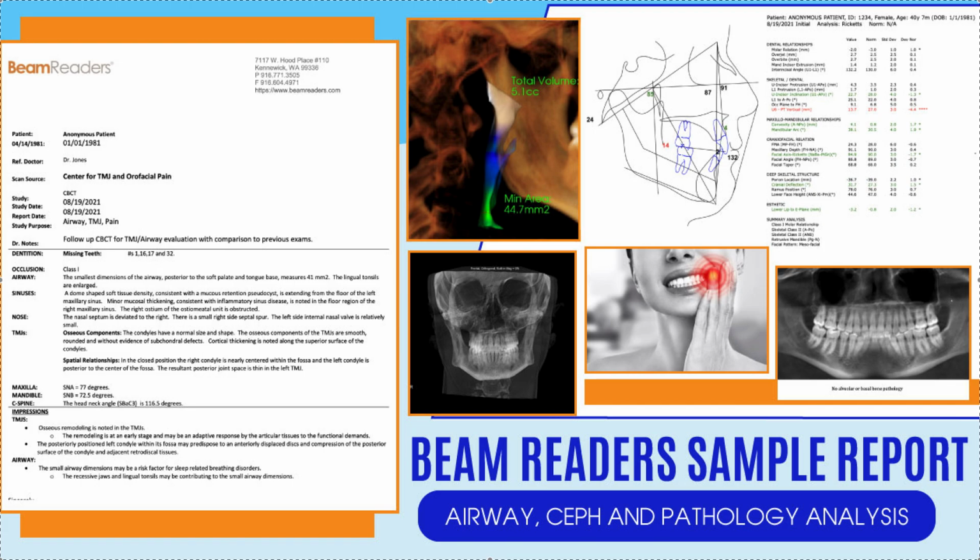And a few weeks ago, I did a little report, content on Beam Readers. Beam Readers is one of those radiology services where you can upload your 3D CBCT if you have one, and they'll have their licensed radiologists spit out a report on pretty much everything from airway to pathology, to Ceph analysis, so many different things you can do.